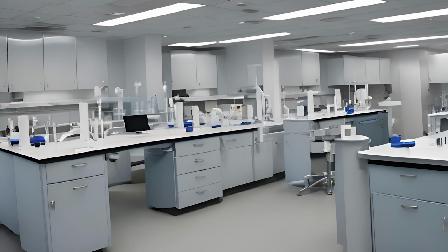You have to label your tubes in front of the patient. The person whose blood you draw has to see you label those tubes. So if you have them as part of the team holding pressure on that phlebotomy site while you label the tubes, they will patiently wait for you to label the tubes.